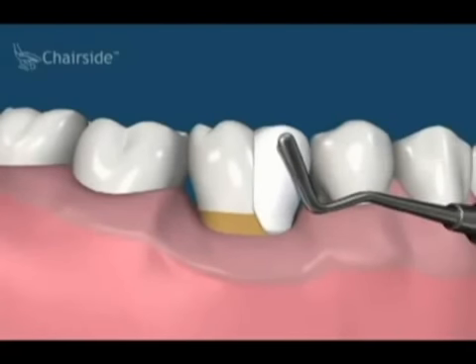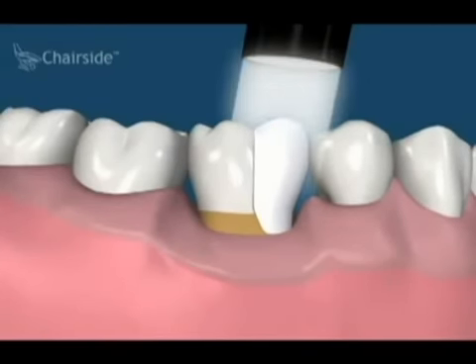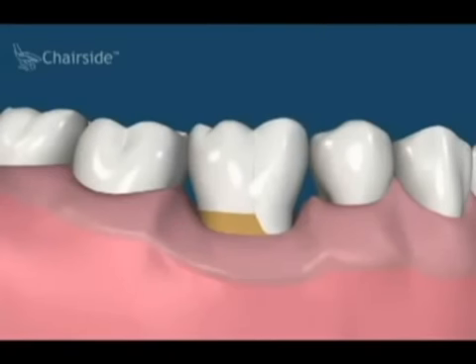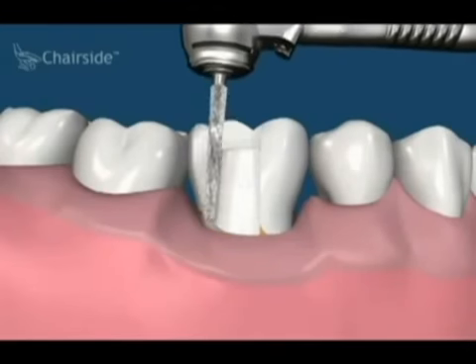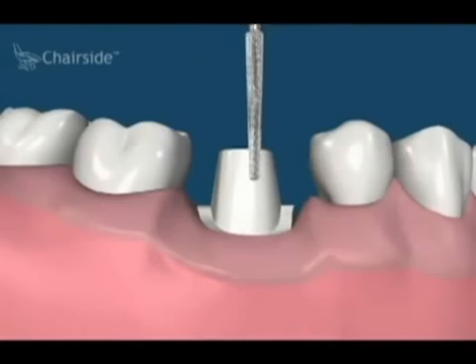In this situation, a light cured resin filling is used first to replace the lost cusp. This may be adequate in some situations, but the best way to restore a tooth with a large fracture is with a crown. The tooth is prepared and the crown cemented on top.